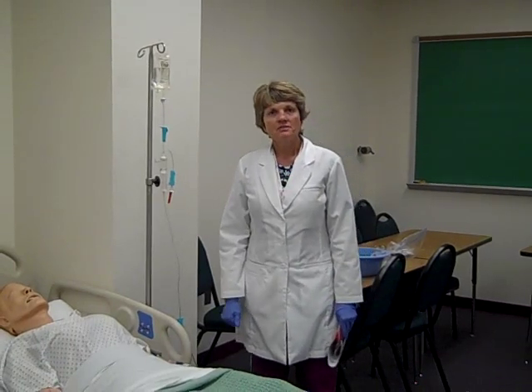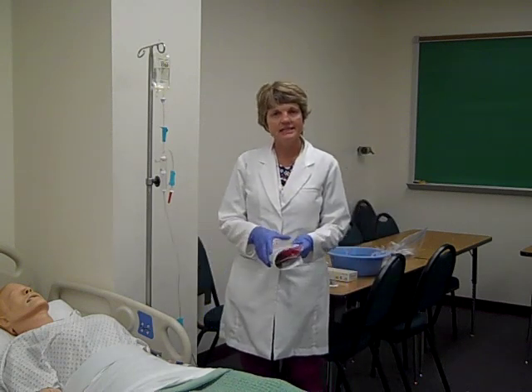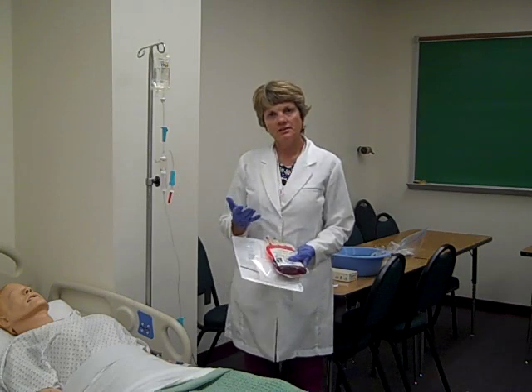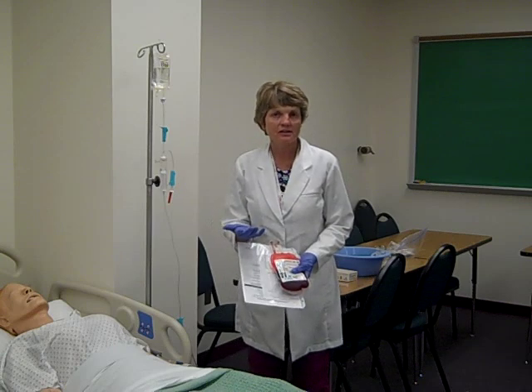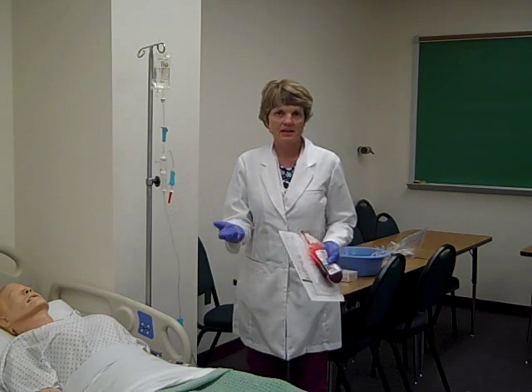Hi, this is part 2 of blood administration, and I just got back from the blood bank with my unit of packed RBCs. I just want to remind you also, don't forget that you must do patient teaching regarding a unit of blood. Explain to the patient signs and symptoms that they need to be aware of in case they experience them, and then they need to call their nurse ASAP.